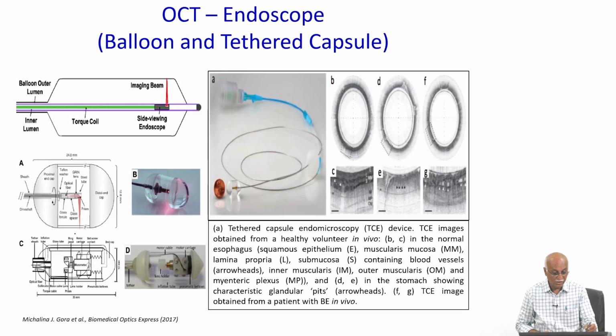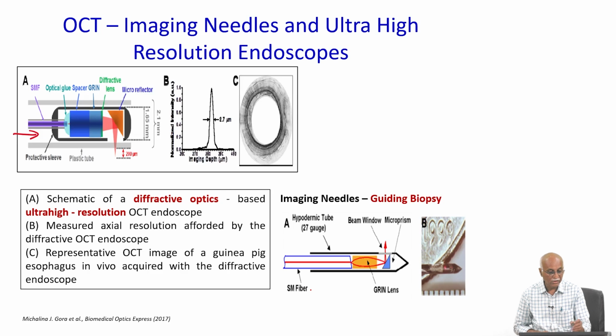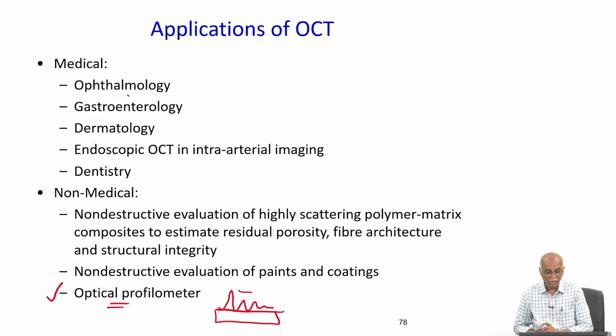And there are different configurations. I have given some references over here. It can allow us to image the tissue structure circumferentially. So, here it is some stomach tissues, it can capture this. It is an endo microscopy approach to visualize this, basically imaging the tissue structures, etc.